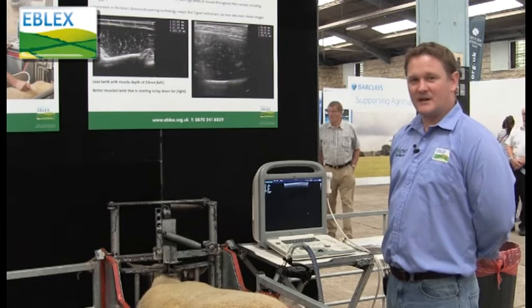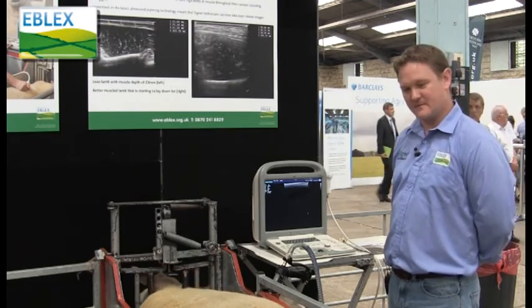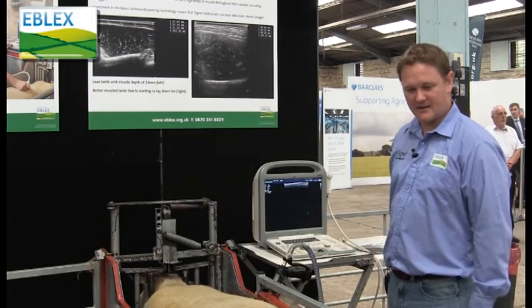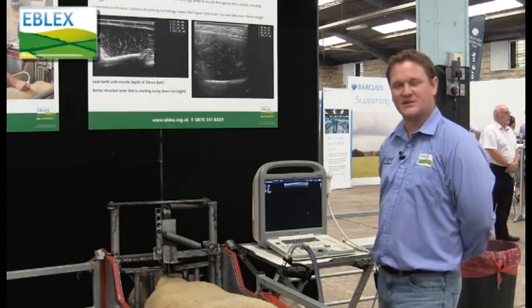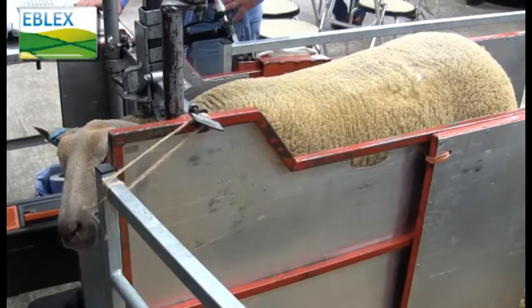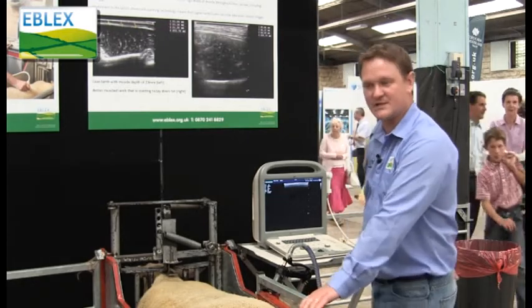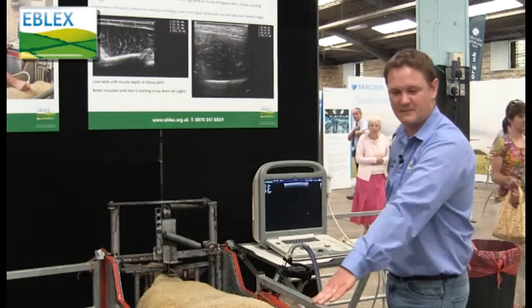Hi, I'm Rob Payton, I'm the breeding technician for Signet Breeding Services and I am the on-farm scanner. I go around to pedigree flocks scanning lambs in the aim to get the eye muscle depth and fat measurements which go into calculating estimated breeding values.